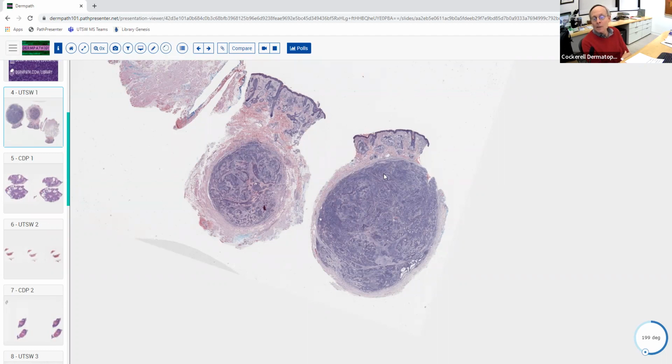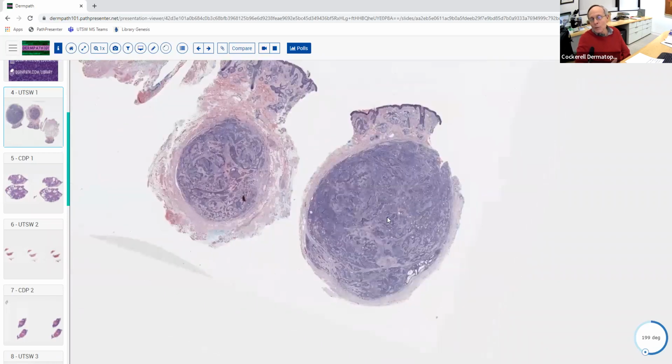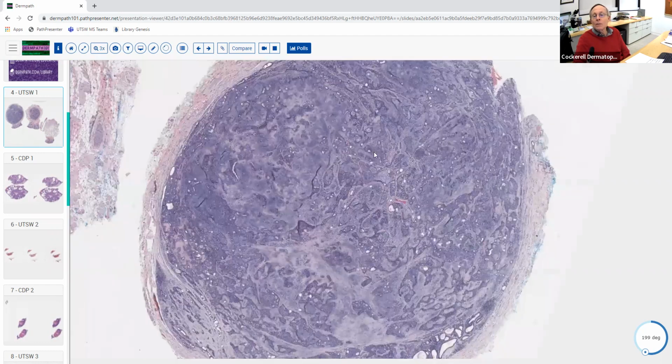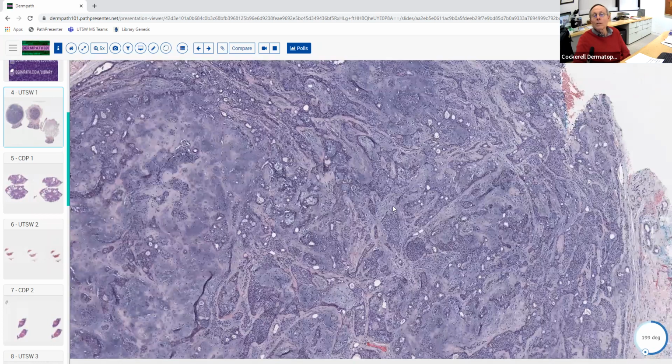So benign epithelial, and it's blue. So you're thinking maybe something basophilic. So we're going to higher magnification. You know, the nice thing about that is when you do that, you can quickly say, maybe it's going to be in the follicular or basaloid category, or maybe it's going to be an adnexal neoplasm. Eventually you can maybe make the definitive diagnosis at low power, but when you're working through it, the low power stuff is good to get you oriented. And then you go to higher magnification and see if there are any other features that allow you to make a more specific definitive diagnosis.